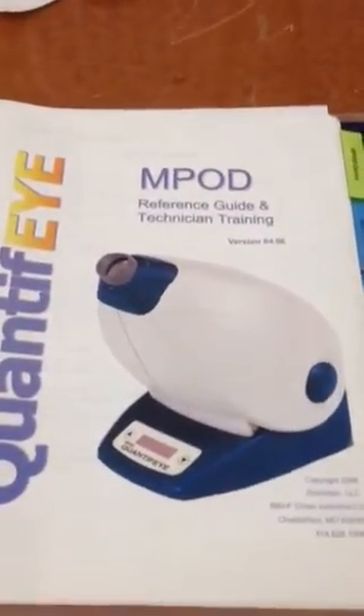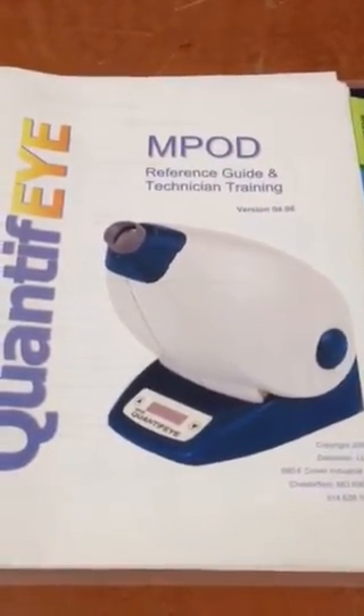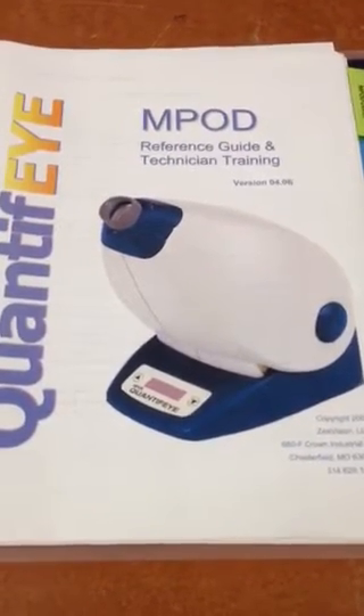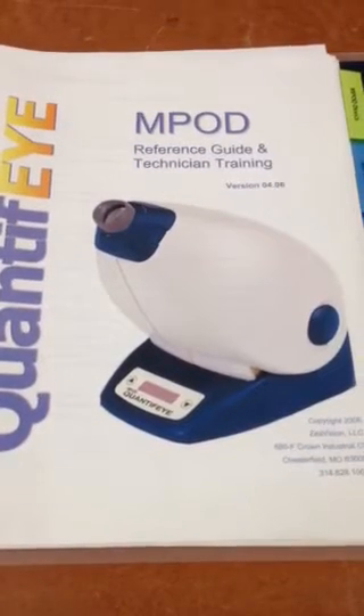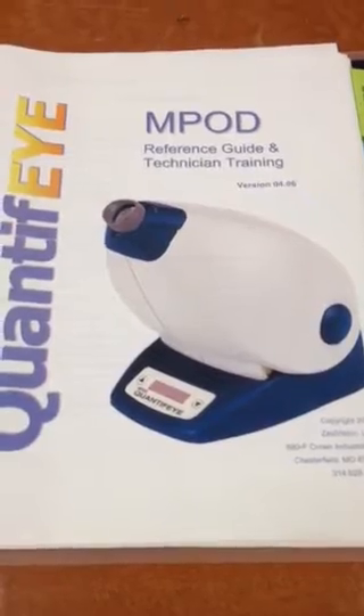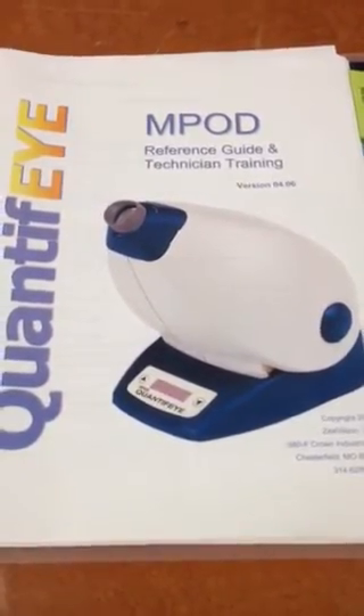This device uses the entoptic phenomenon known as Maxwell's spot to demonstrate to the patient and the clinician how the xanthophyll pigments of the macula — lutein and zeaxanthin — are working, how thick they are, and whether treatment is working or macular degeneration is a risk factor for this patient.